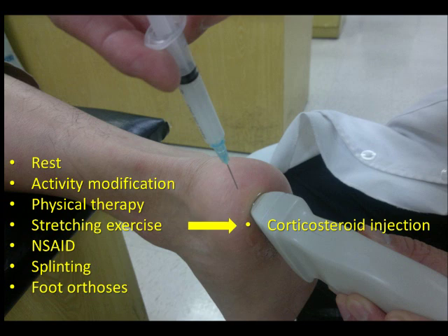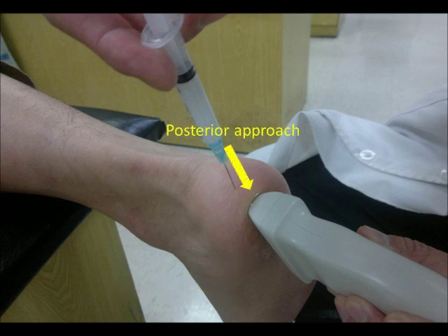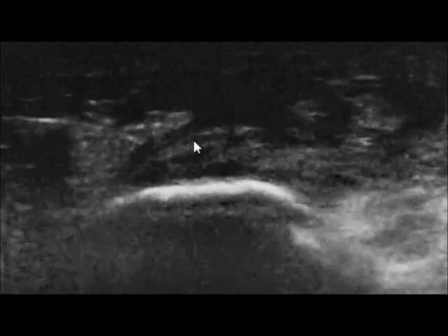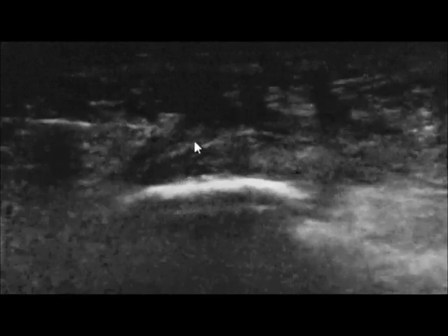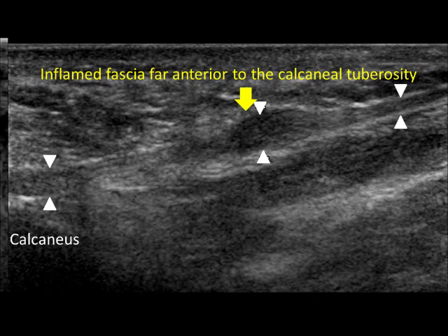Ultrasound-guided corticosteroid injection has been reported to improve therapeutic efficacy by localizing the lesion and placing the needle precisely. The injection is best performed with the patient prone, just like the position for plantar fascia examination. The needle can be inserted by a posterior approach or a medial approach. Most recommend the posterior approach, which allows easier access to the posterior fascia region. After skin preparation, the needle is introduced along the long axis plane of the probe. The echogenic metallic needle can be easily identified on ultrasound. A 21 or 23 gauge long needle is preferred because the lesion can be more anterior to the calcaneal tuberosity. If the lesion is far anterior, a medial approach is preferred.